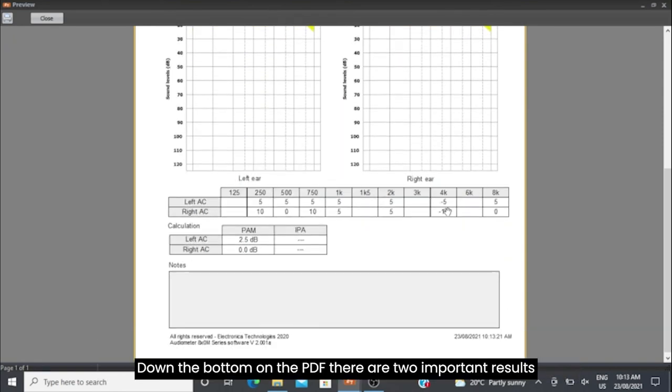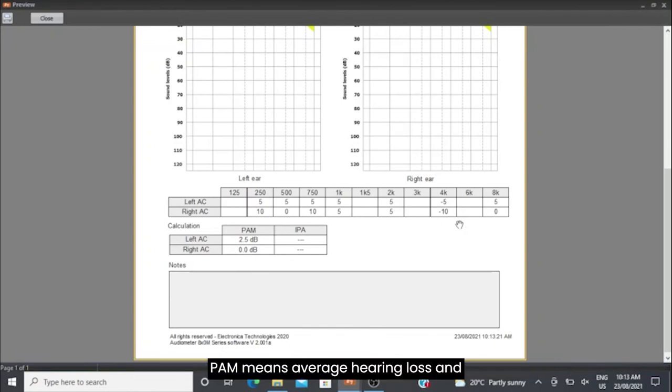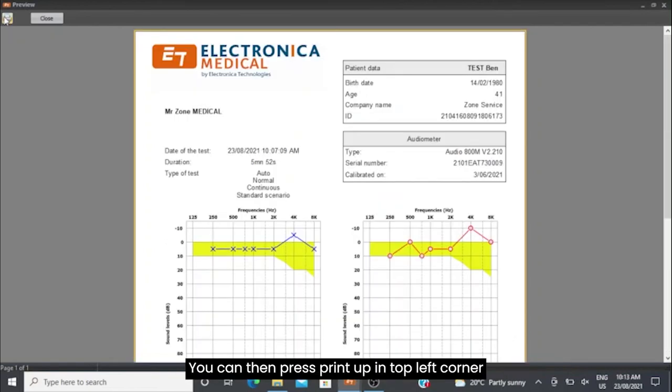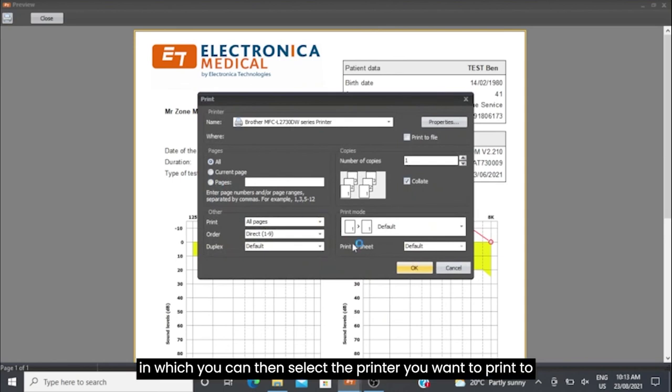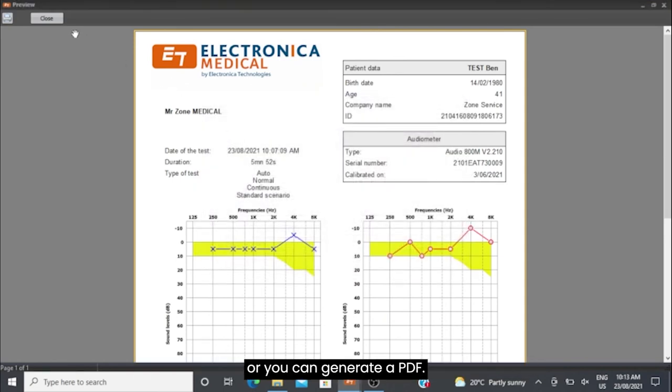At the bottom of the PDF, there are two important results: PAM and IPA. PAM means average hearing loss, and IPA is an early warning indication for hearing loss. You can then press Print in the top left corner, where you can select the printer you want to print to or generate a PDF.